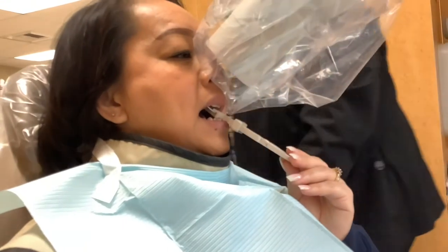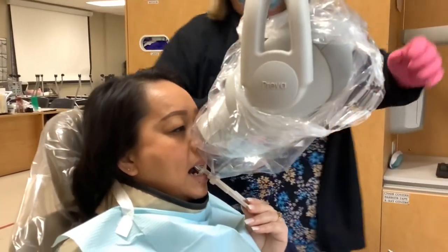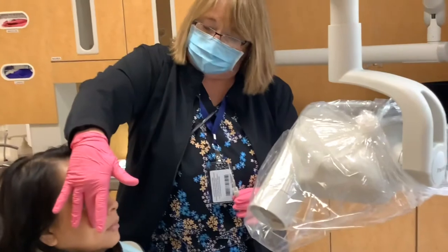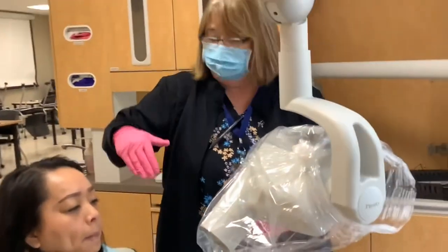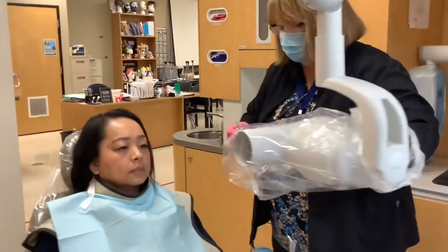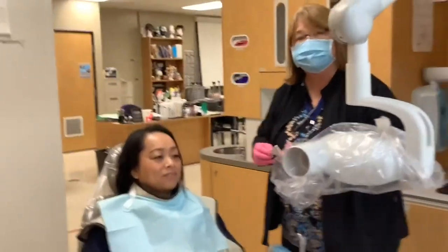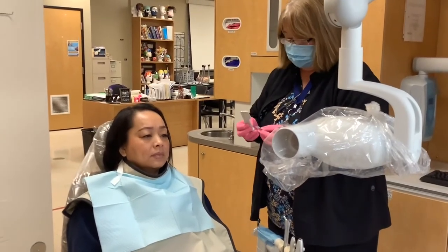Walk away and hit the button. That goes back to 45 on the cuspid, 30 on the bicuspids, and 20 on the molars — same angulation, just on the different side. Now we go down to the lowers. I don't have a cool song, but I have: 5, 10, 25, 20. The uppers make a better song.